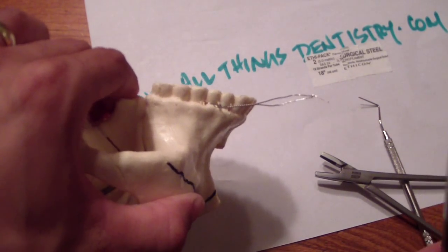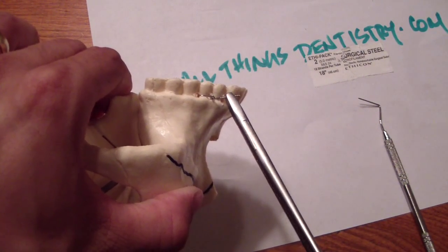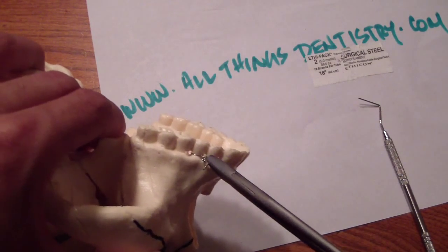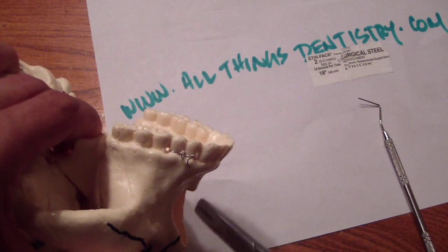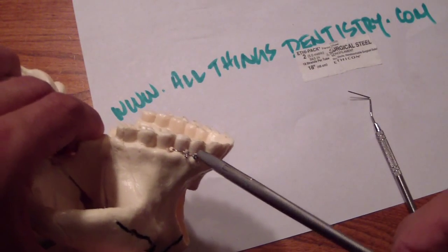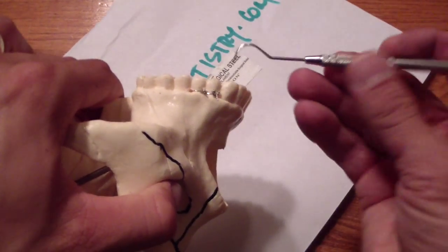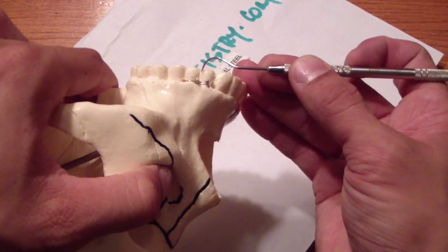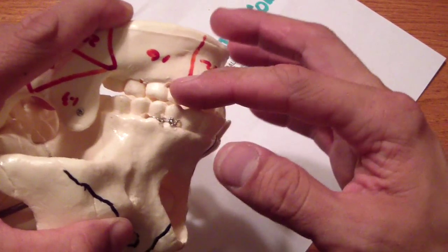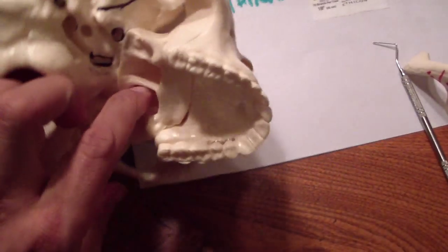What I'm going to do is cut this off and take a Woodson — in this case a Woodson with a couple of grooves in it, called a pickle fork — to make a rosette. Just push that either under a wire or an interproximal area, and there you have it. You've got this little ivy loop, and next I'm going to place an ivy loop down here and then fixate them together. Thanks for joining, cheers!